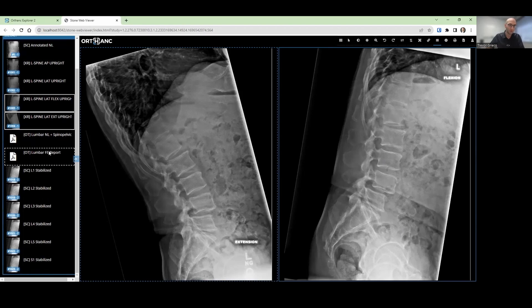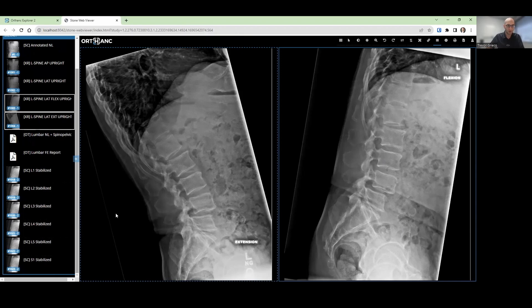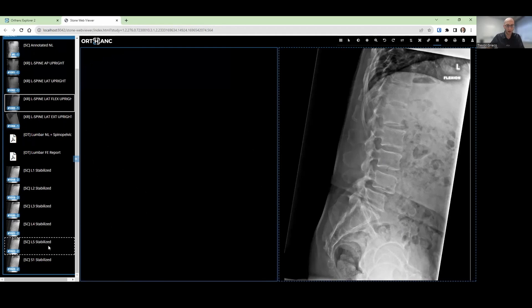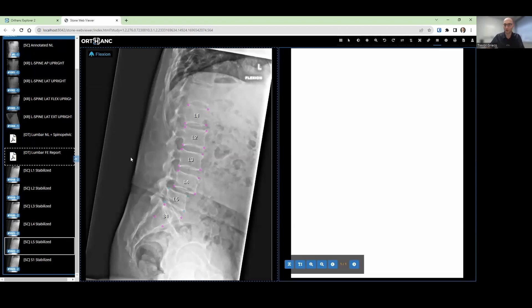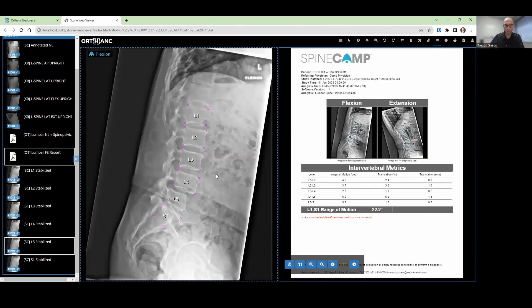You can see that we've delivered back quantitative reports in what we call stabilized series. So I'll pull in that data right now — pull in the L5 stabilized series, since it's the level of interest with the spondylolisthesis. And I'll pull in that flexion extension report here.